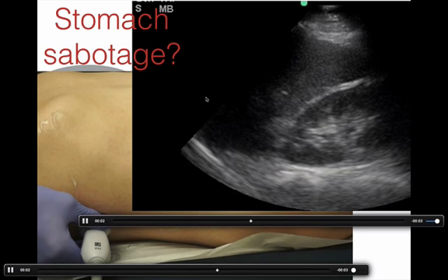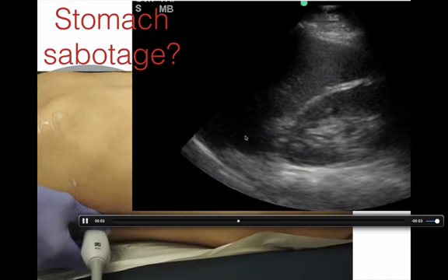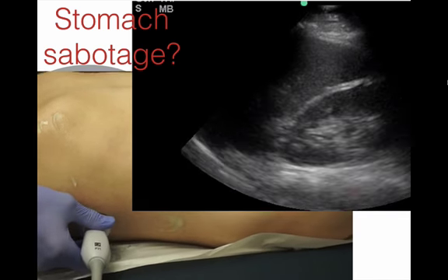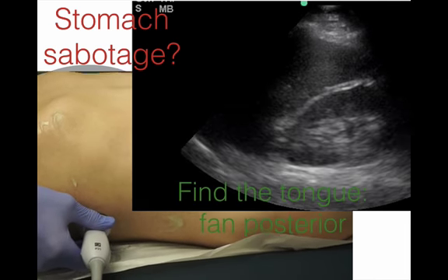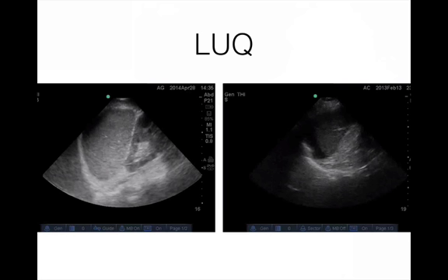So stomach artifact with some shadowing. You can see that it basically disappears when you just tilt a little bit more posteriorly. So again, find that tongue, find that medial part of the spleen to ensure that you're actually imaging the most posterior aspects of the spleen. So again, this is that nice little tongue of the spleen right here, that medial tip of the spleen. And then this is free fluid not in the splenorenal recess or potential space, but actually underneath the diaphragm. So this is a subdiaphragmatic recess with free fluid.